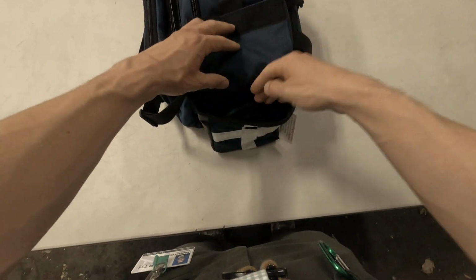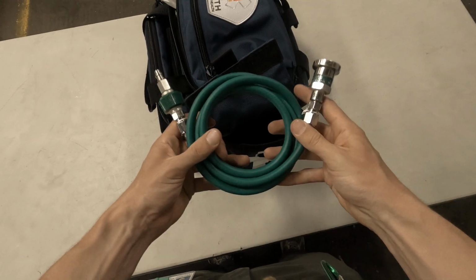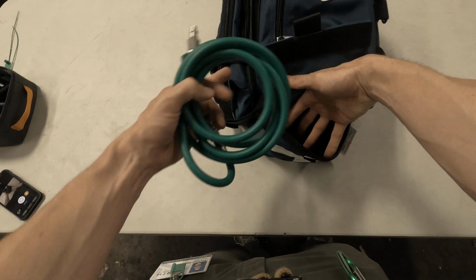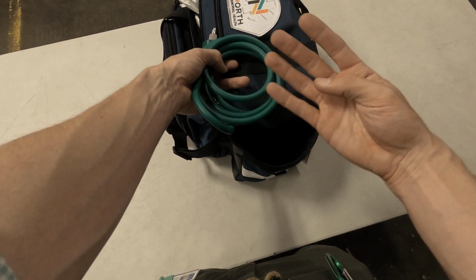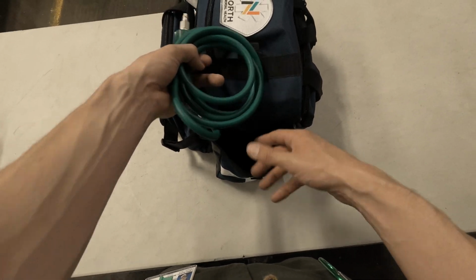We'll come over here. So this extension tubing is in the side pocket. This bag doesn't have the U of M adapter or the Fairview adapter, which is in all of the other bags. We have 4 of those currently. I'm working on getting a 5th, 6th, and 7th just for spares.